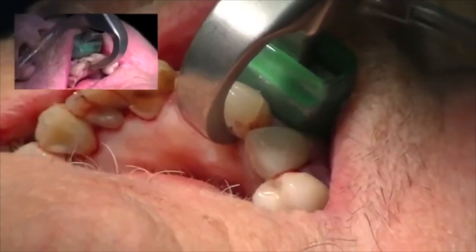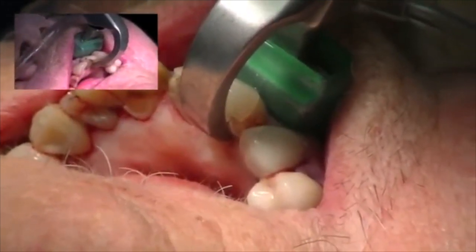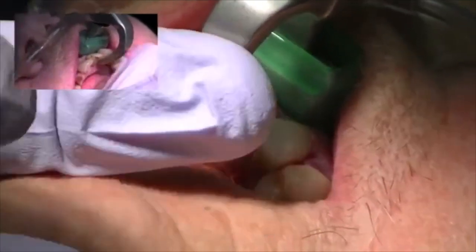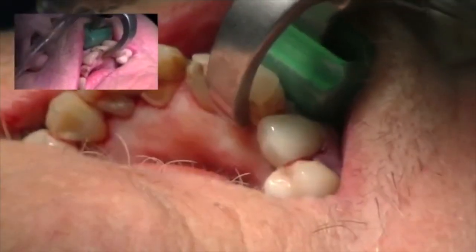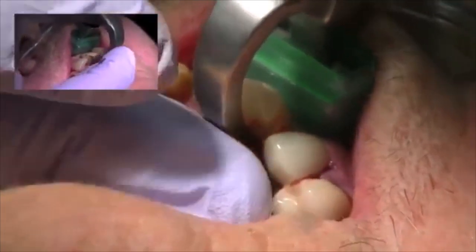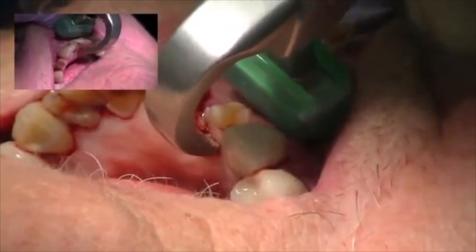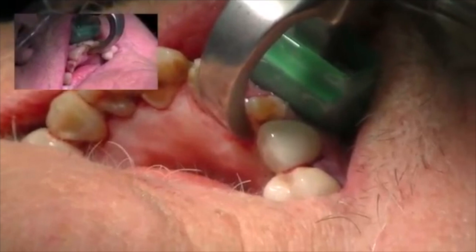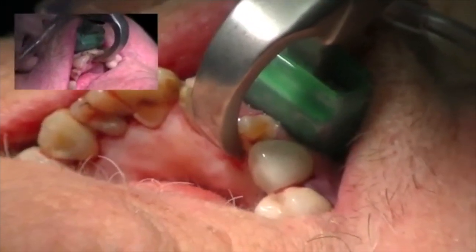I'm going really, really slow. You can see the tooth move a little bit — the filling may be coming off. The instrument is intended to move the tooth maybe two or three millimeters; it's not intended to remove the tooth in total. There's a big filling here, so you have to be very conscious of that. What's happening with the forcep is it acts as a class one lever, or a modified class one lever, creating tension onto the periodontal ligament.